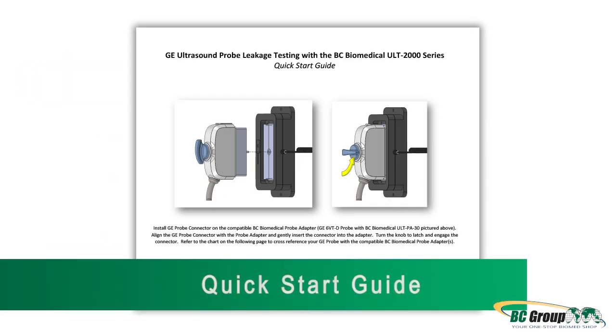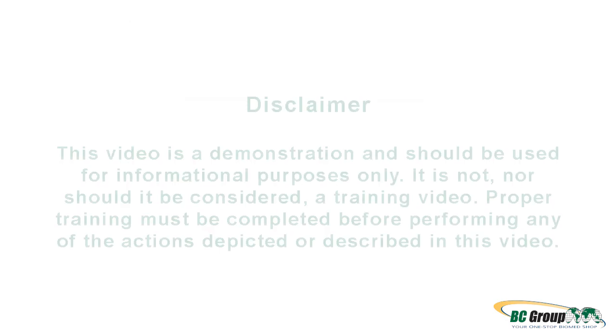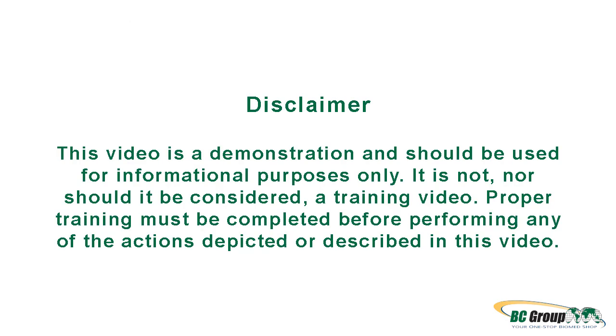Prior to testing, please review the Quick Start Guide: GE Ultrasound Probe Leakage Testing with the BC Biomedical ULT 2000 Series. This video is a demonstration and should be used for informational purposes only. It is not, nor should it be considered, a training video. Proper training must be completed before performing any of the actions depicted or described in this video.